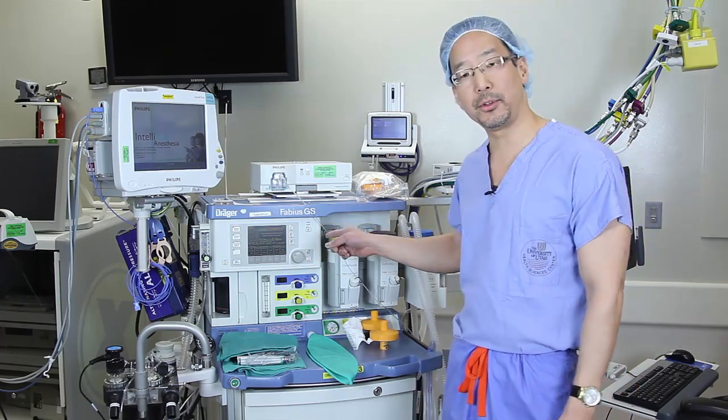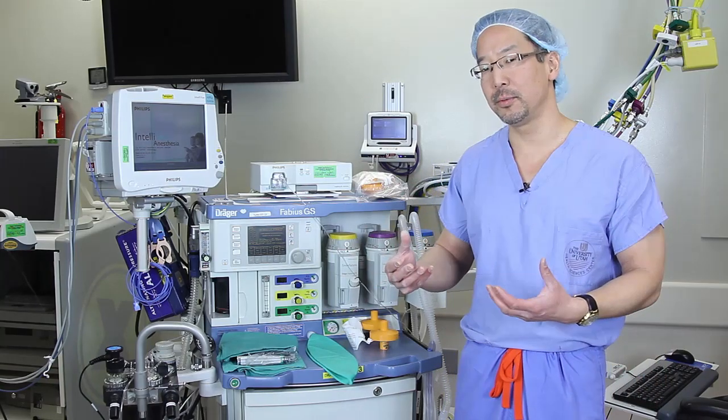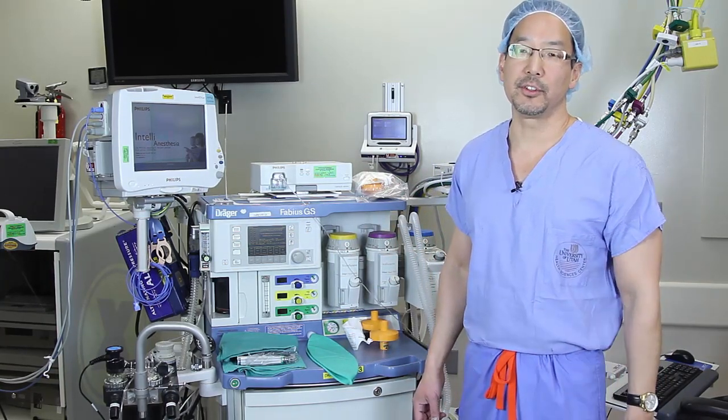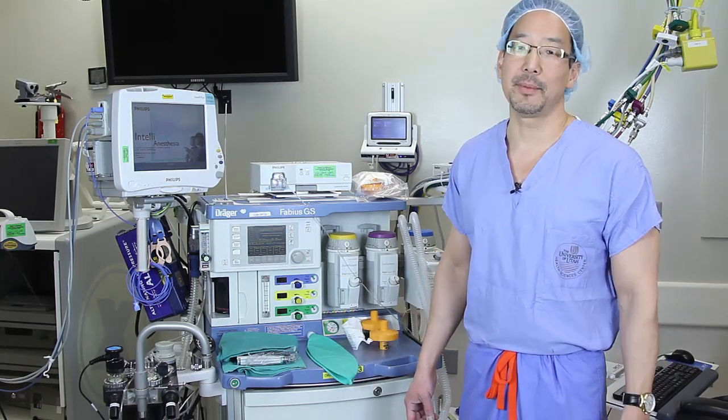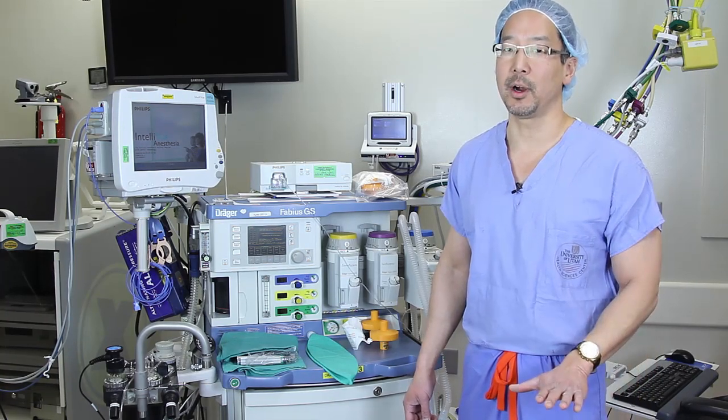It's important to realize that although I'm showing you on a Fabius GS machine today, the principles that I'll be teaching you apply to all anesthesia workstations. The issue with newer anesthesia workstations is that they contain a significant amount of elastomeric parts and plastics that make it increasingly more difficult to flush your machine to get below five parts per million.